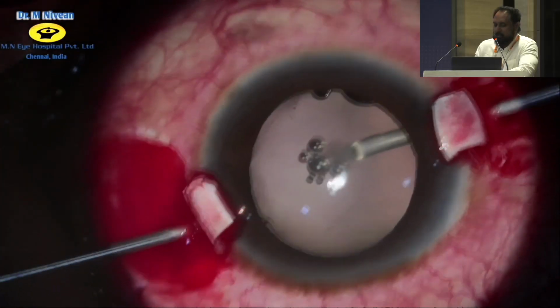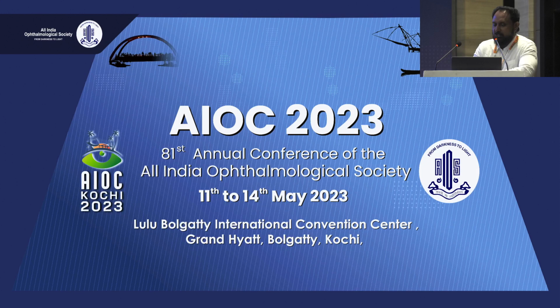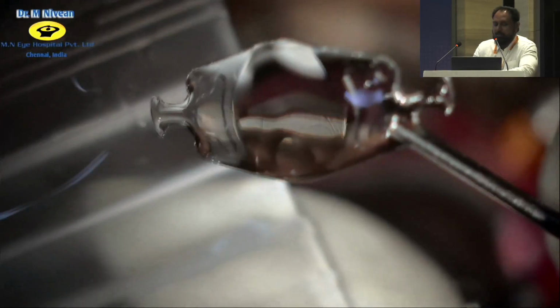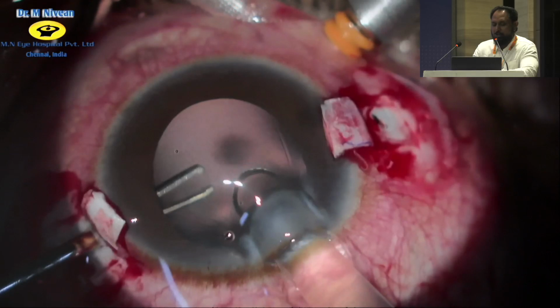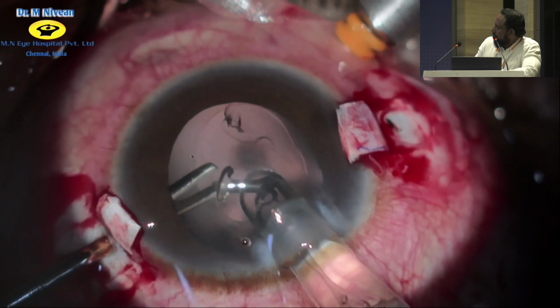So once the lensectomy was done, this is the new lens that I was talking about that I invented, the CMT Flex lens with specialized T-shaped haptics. So these T-shaped haptics, when you bring them out of the sclerostomy, open up and just stay in position. So you don't have to do any tucking or suturing. We have specialized Prenu T-Flex forceps that you can see has this broad tip. And this can be done through a clear corneal incision because it is a foldable lens, isn't it?